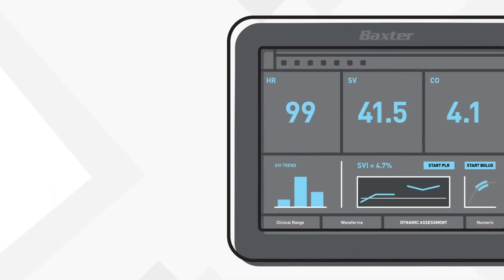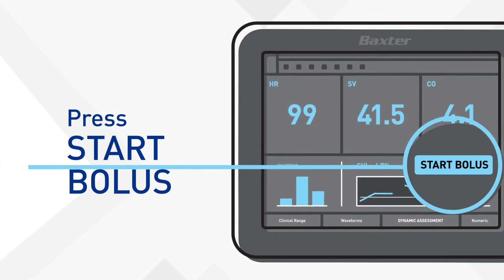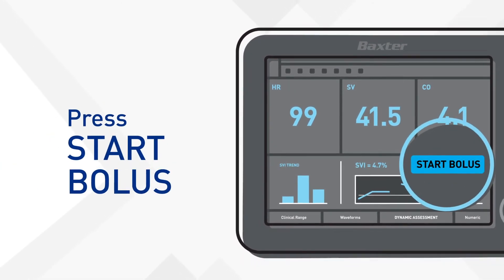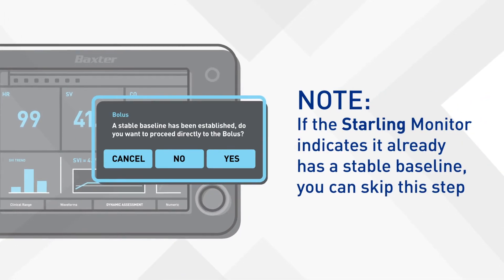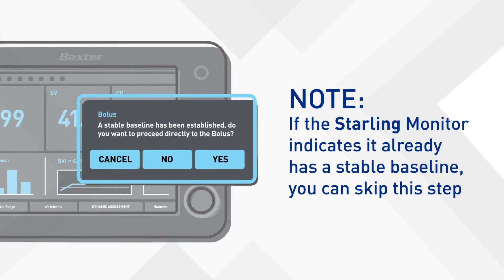Now you're ready to start. Press Start Bolus — you'll find it on the dynamic assessment dashboard. First, you'll need to establish a baseline. If the Starling monitor shows it already has a stable baseline, you can skip this step.